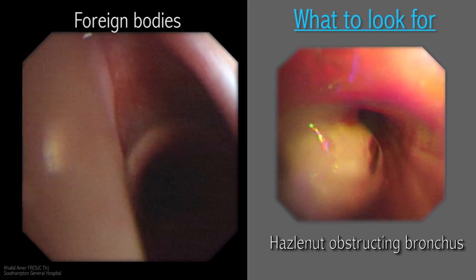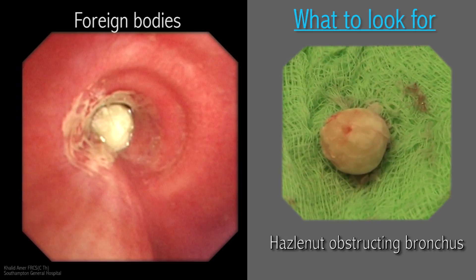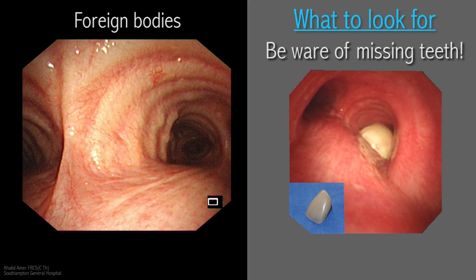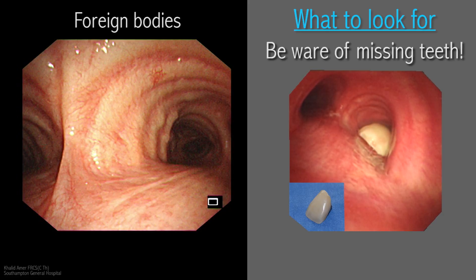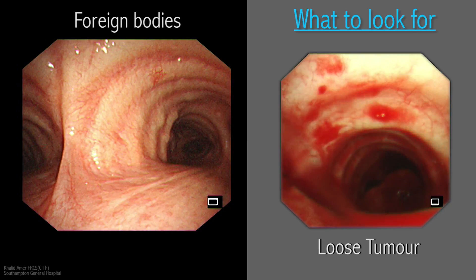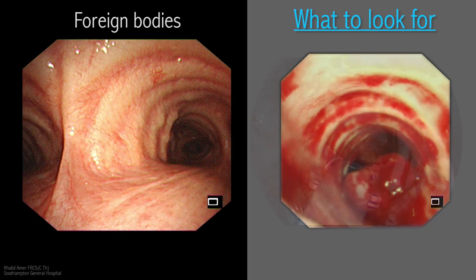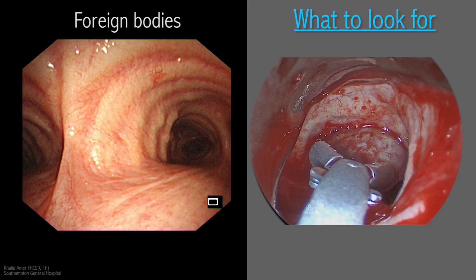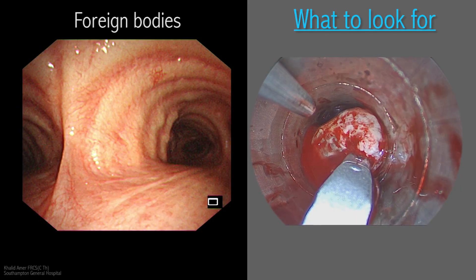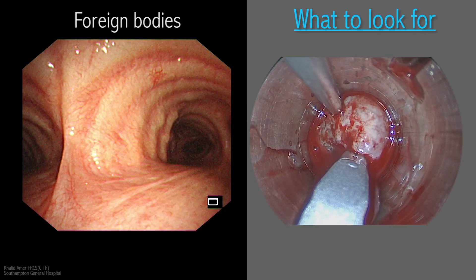Foreign bodies are common and might be challenging to remove. If they stay long enough, chest infection ensues and sometimes during bronchoscopy they are marred by the presence of pus. Not all foreign bodies are incidental or accidental — they could be iatrogenic. We were reminded by the anaesthetist at the end of one bronchoscopy that one of the incisor teeth was missing; we reintroduced the rigid scope and retrieved the tooth from the right main bronchus. Free tumour in the central airways can cause dynamic obstruction usually related to posture; these are carcinoid polypoid lesions which have outgrown their blood supply and avulsed from their origin. Removal follows the same principles of foreign body removal: the tumour is brought into the rigid scope and the whole mechanism is withdrawn out of the patient.